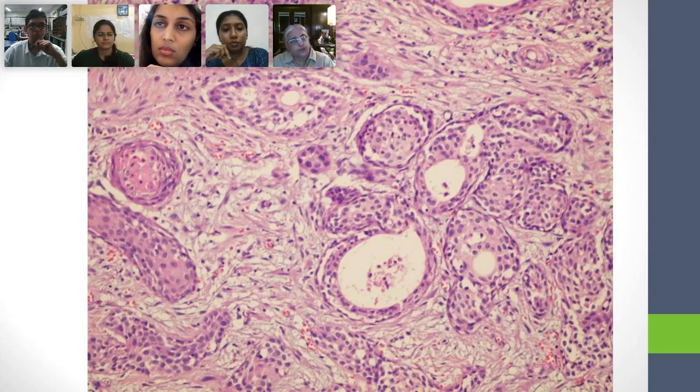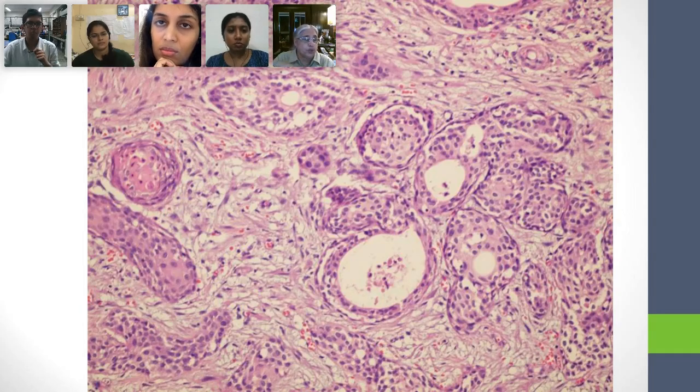Whenever we see cribriforming inside a duct, what should we be noticing next? Because we see it in the breast. Some necrosis. Necrosis. All right. There's no necrosis over here. Well, there's something that's fallen off. Okay. What do you want to say? You want to see whether those spaces are a sieve-like thing. Cribriform means that it's got holes like a sieve.